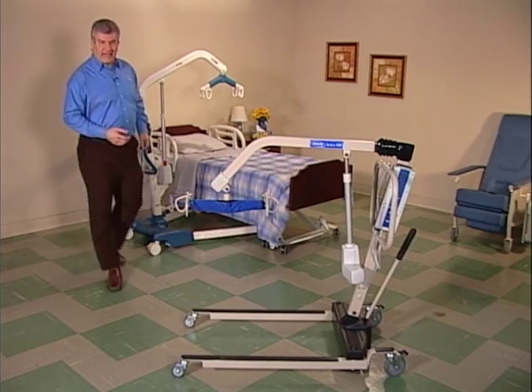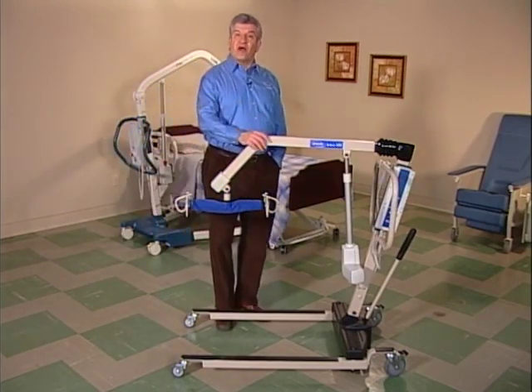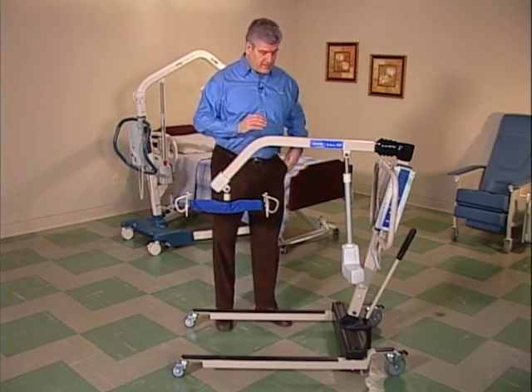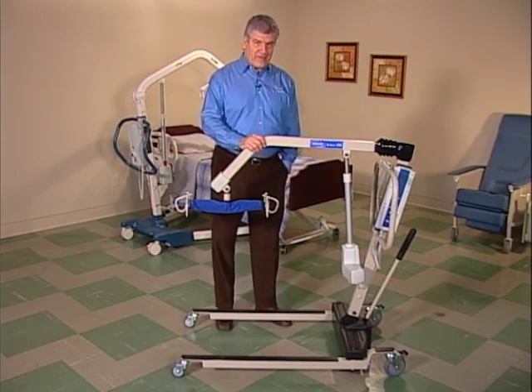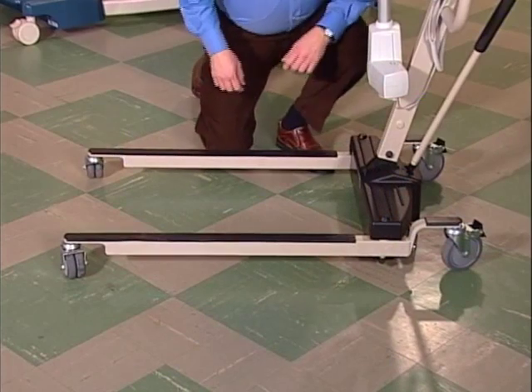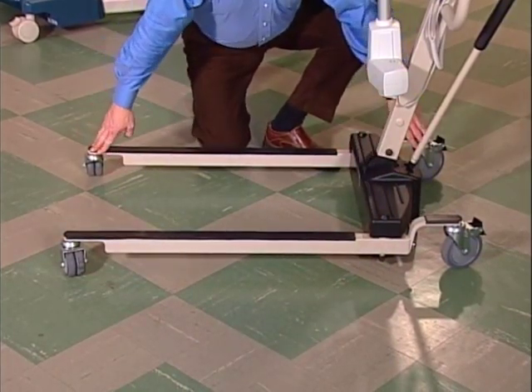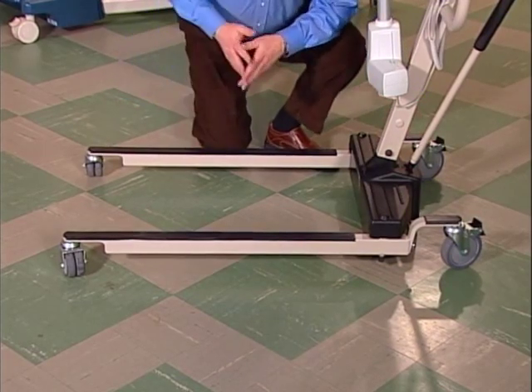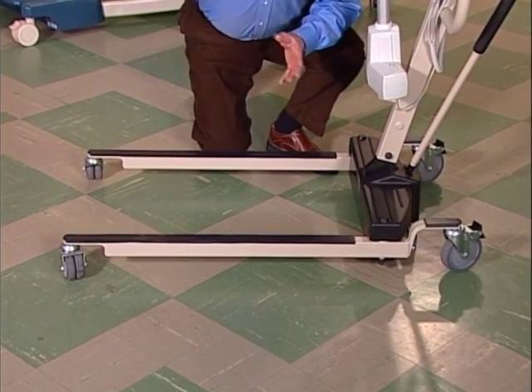To get a better understanding of a Reliant or Jasmine lift, it's good to know the parts. Basically, the lift is made of three assemblies: the base, the mast, and the boom. Let's start at the bottom and work our way up, beginning with the base. The base rides over the floor on these four low-friction casters. The rear ones are lockable — a feature that comes in handy when you're adjusting the sling for initial setup on the patient.